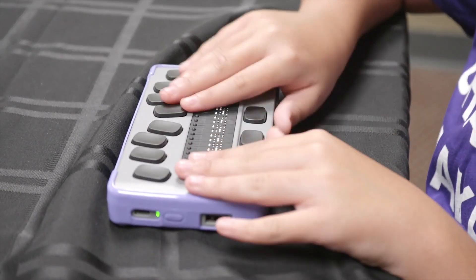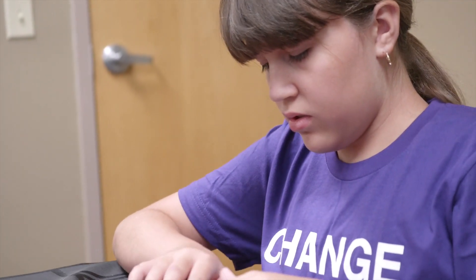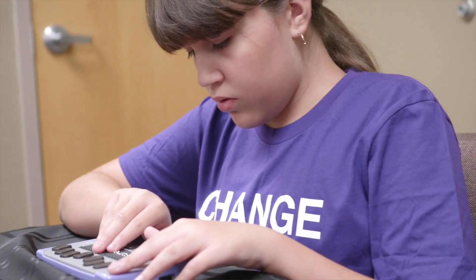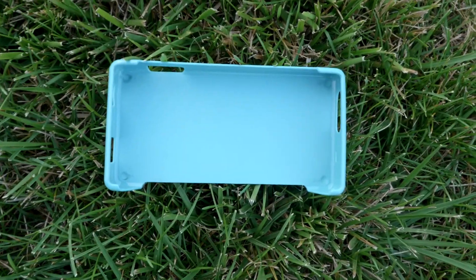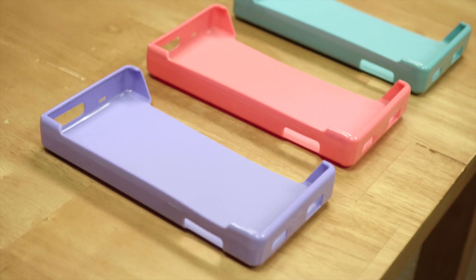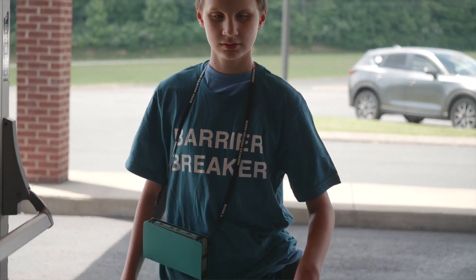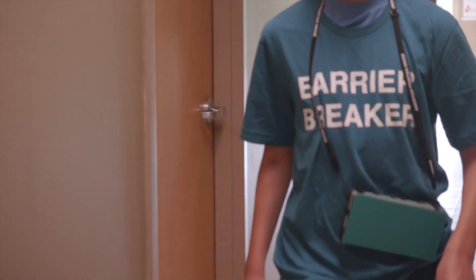The Chameleon will come with three different color cases that a student can put on to customize it based on their taste and how they feel. It will have a teal case, a pomegranate case, and a purple case. In addition to the different color cases, there will be an actual carrying case with a strap so that the student can wear the device on their body if they choose.